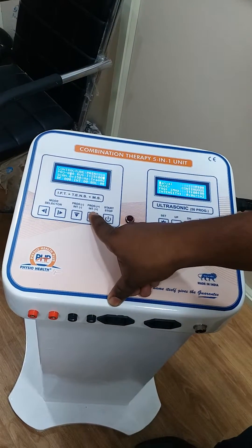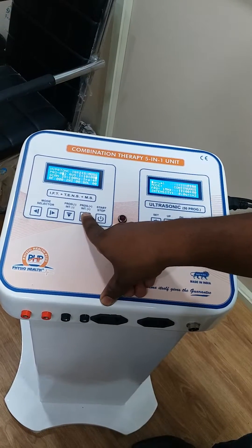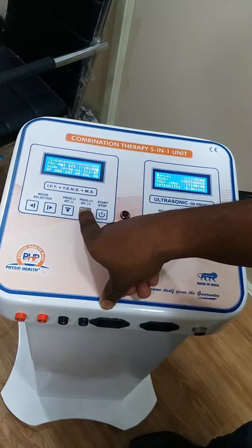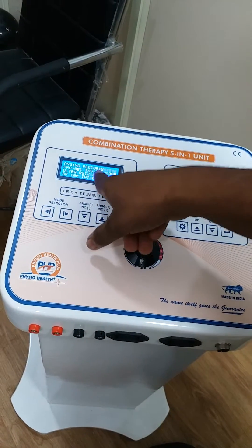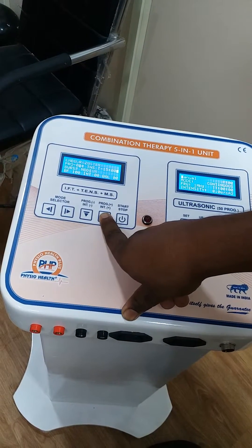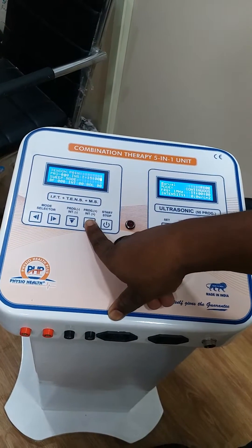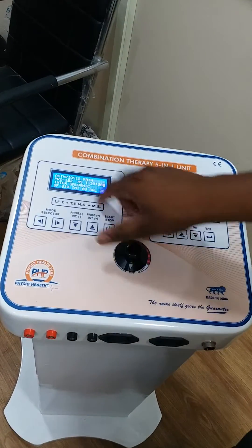Programs 1 to 70 are IFT programs. After that, programs 70 to 100 are TENS programs. Program 71 onwards are TENS programs, and after 100 are MS programs. Here are the three modes: IFT, TENS, and MS — you select according to your need.